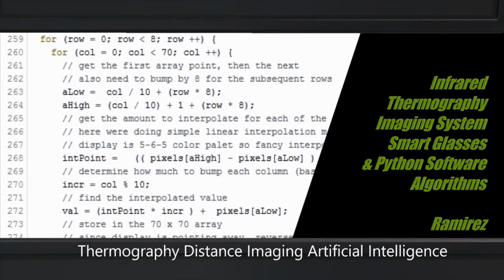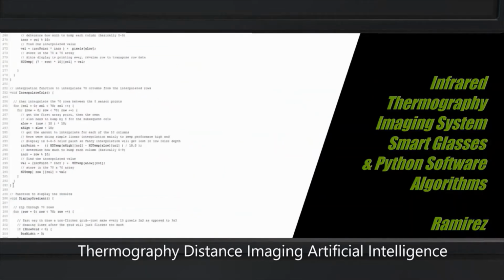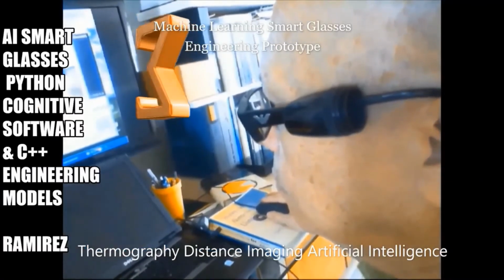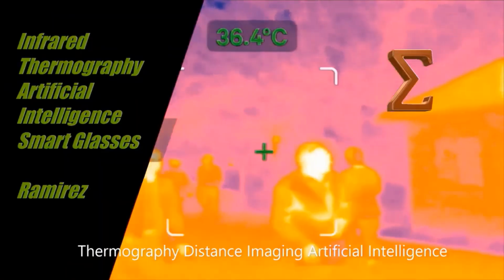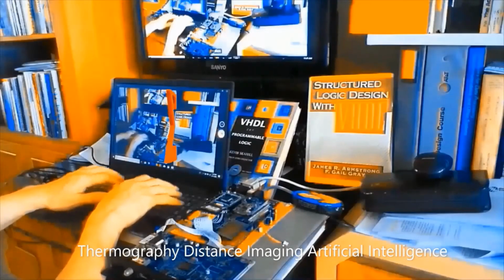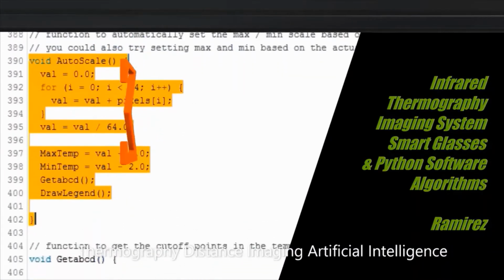The images taken in this way can be recalculated to present a temperature image of the recorded group of people or objects. A false color representation allows the various temperatures to be visualized using various colors in a clear way. This allows the user to identify warm or cold areas very easily based on the image.